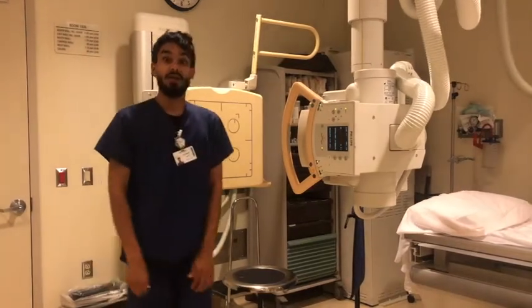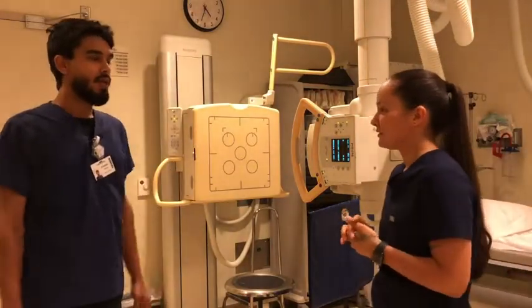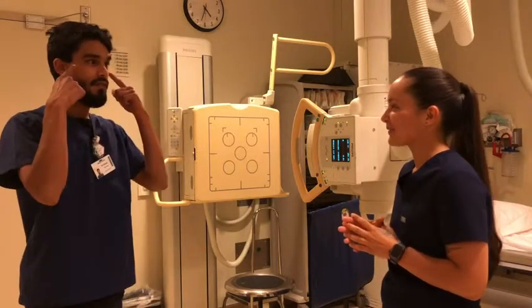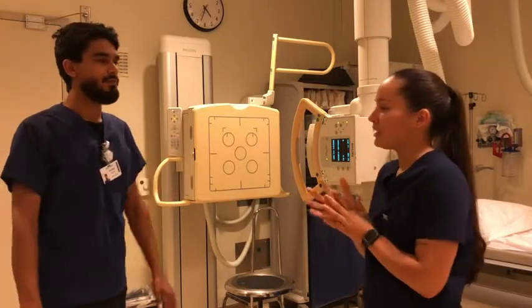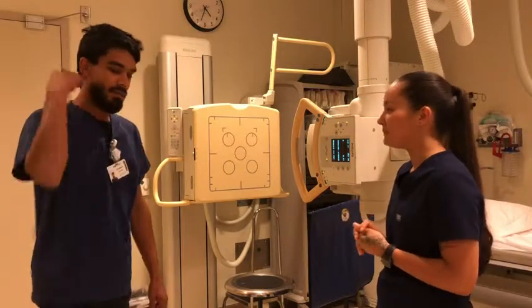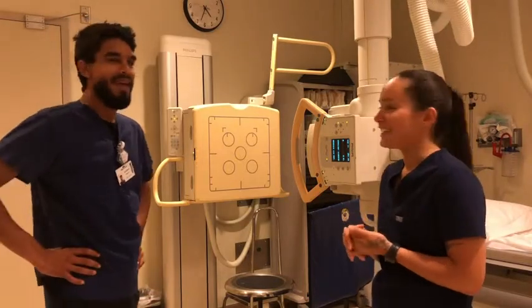And we're going to get our patient. Hello, Ms. Hewitt. Yes, my name is Omar. I'm with X-ray. The doctors want to get some pictures of your sinuses. So first of all, can you tell me what your full name is? Yes, it's Miley Hewitt. What's your birthday? 06/07/1991. Awesome. Is there any chance that you could be pregnant? No, not today. Okay, let's keep it that way.